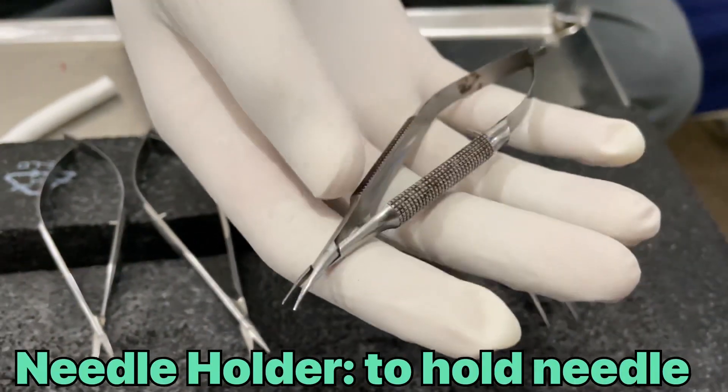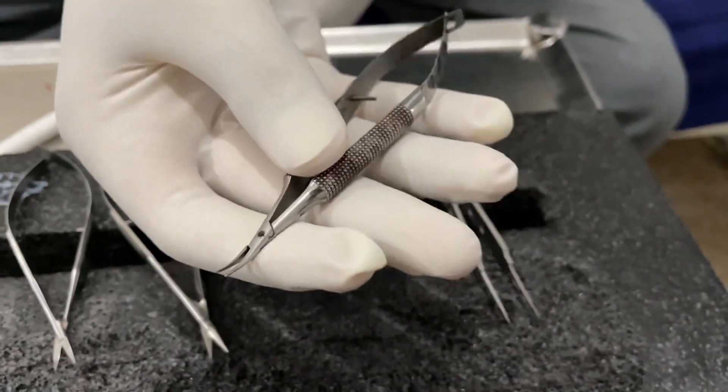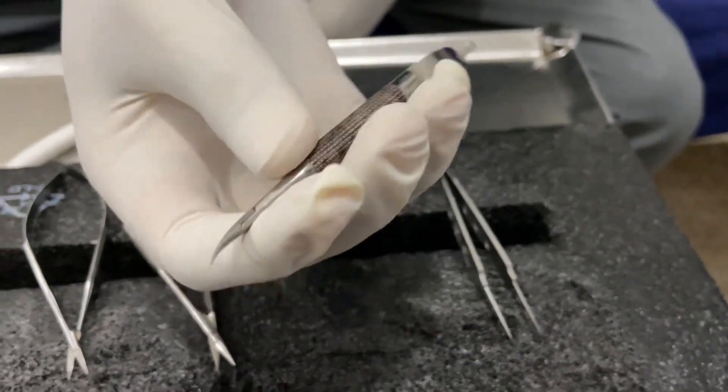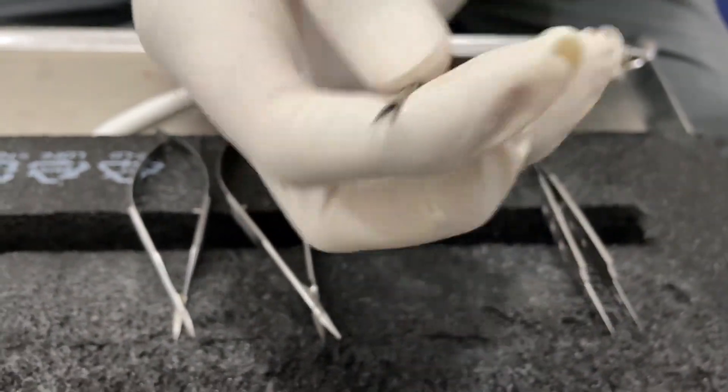This is an ophthalmology instrument. The needle holder is a bit different from the normal needle holder as used in general surgery. But this is the needle holder in ophthalmology.